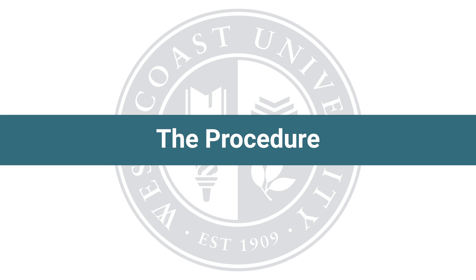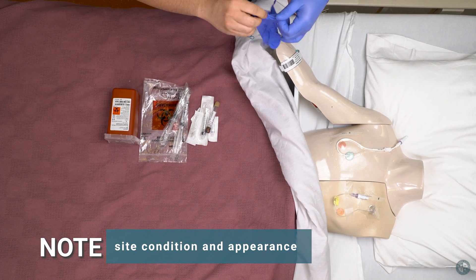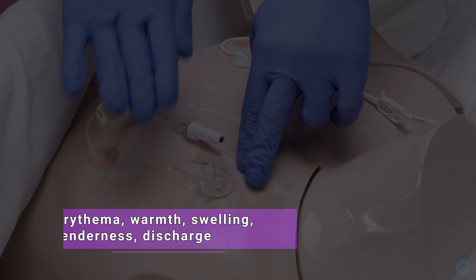The procedure. Note site condition and appearance. Check for any indicators of infection, such as erythema, warmth, swelling, tenderness, or discharge.